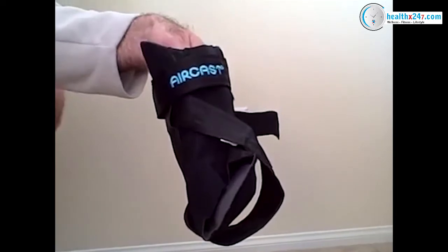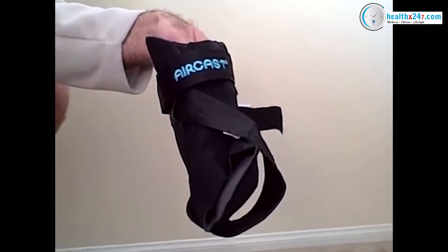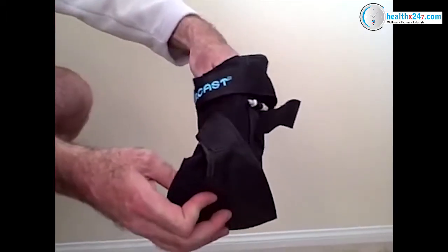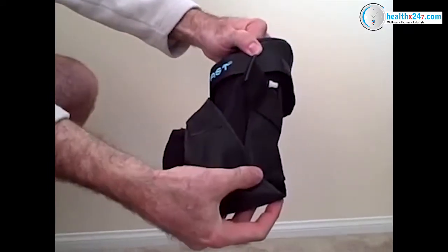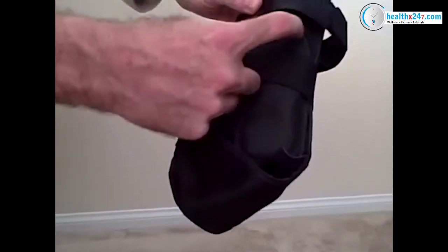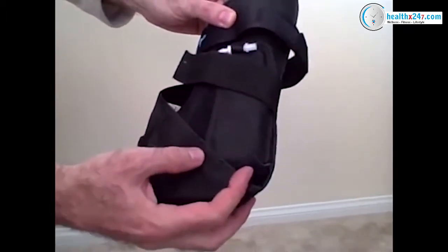This is the AirCast AirLift PTTD Brace. This is a new model from AirCast which is specifically designed for posterior tibial tendon dysfunction. It features an air bladder system located underneath the arch, which is inflated with a special bulb that screws into the side and inflates underneath the arch.